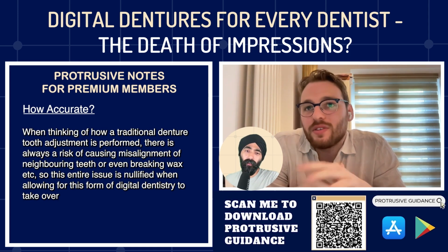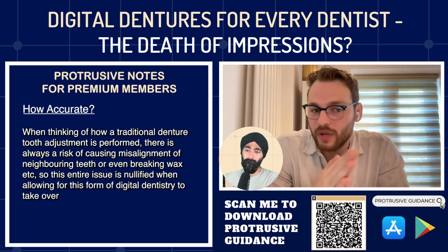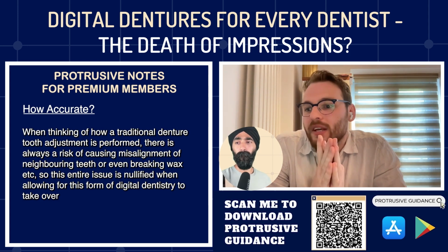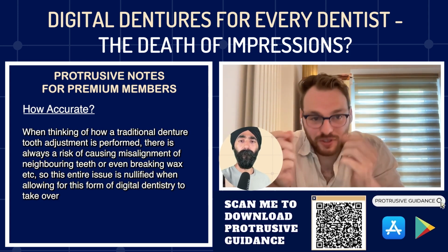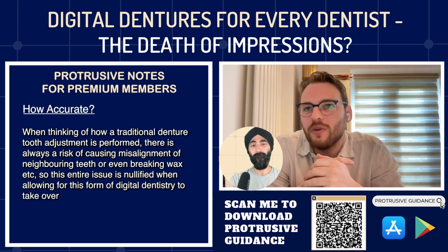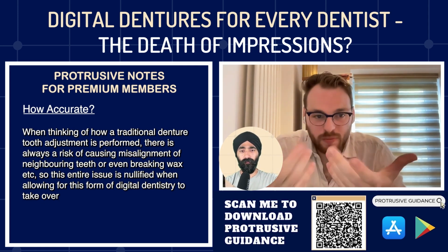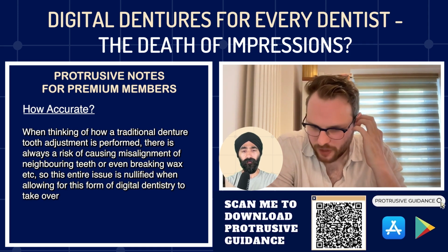Absolutely. So yeah, that's one of the areas where the workflow is a little bit more challenging, because, as I say, through the MPD I'm sat there a lot more with the wax. I'm a lot more comfortable with moving the teeth around and things like that. Generally the bite's pretty spot on already, because it's been worked out by AI and all that kind of stuff.